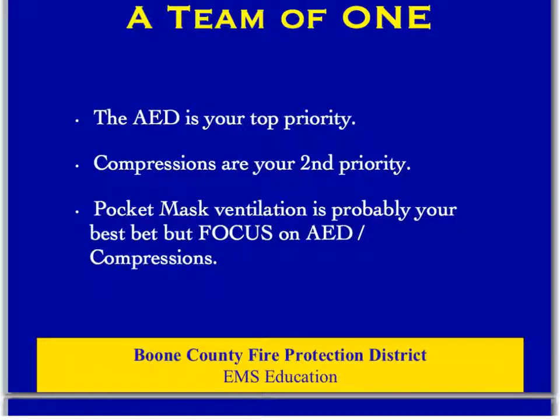So what do you do when you're by yourself with a cardiac arrest patient? Well, your AED is your top priority. The most common heart rhythm that patients are in right after they arrest is VFib. The treatment for VFib is a defibrillation from the AED. So in the case that they're in VFib, in a shockable rhythm, you've got to get that AED on.